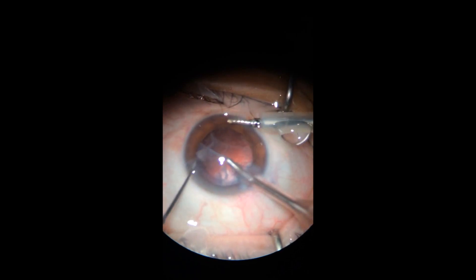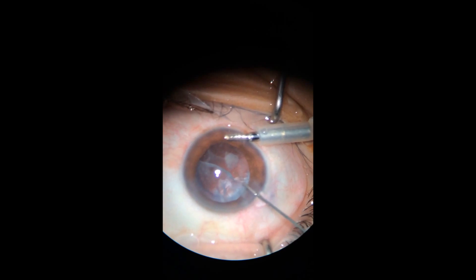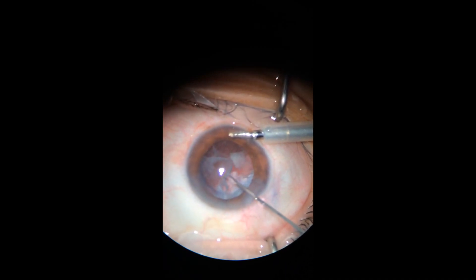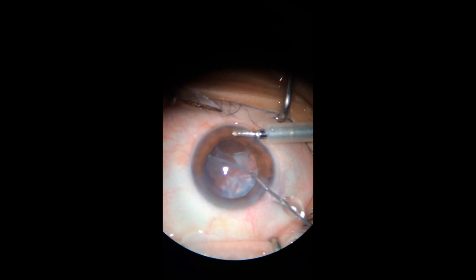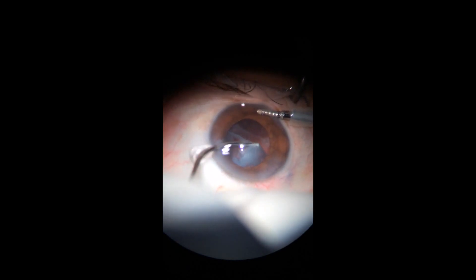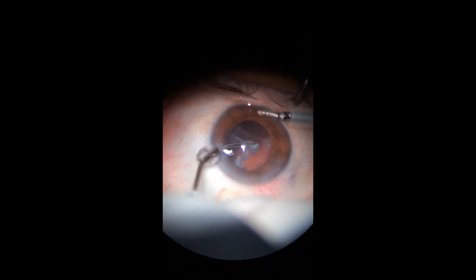We finished the phacoemulsification and right here you can see the membrane between 11 and 2 o'clock. With the Utrata forceps for ILM peeling, I'm pulling on the membrane — as you can see it's very rubbery, and it's kind of taking the whole sac if I insist on it.